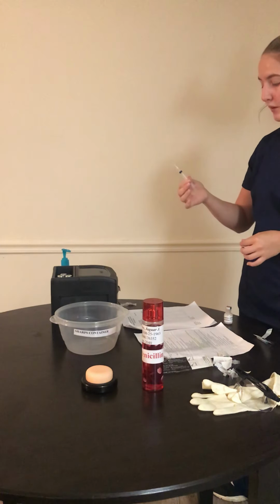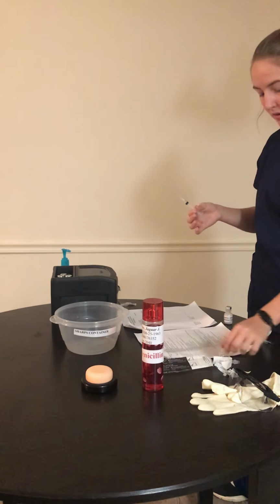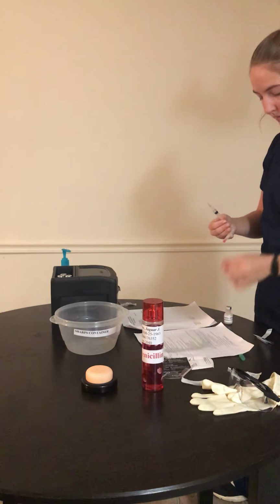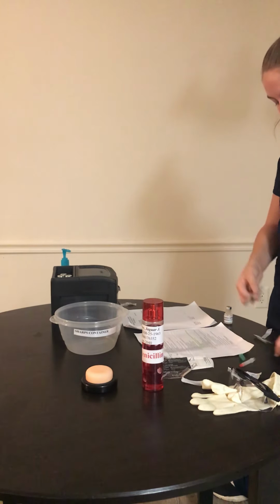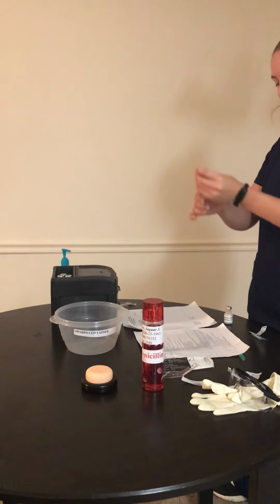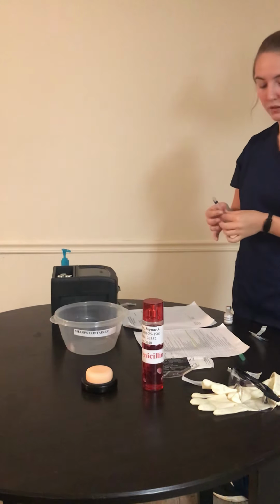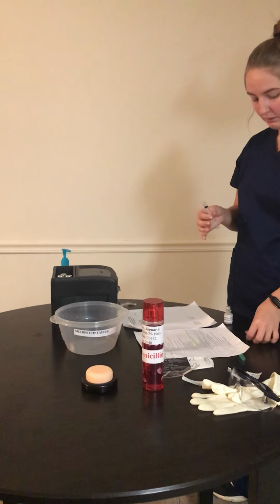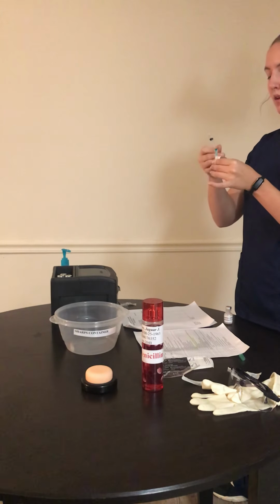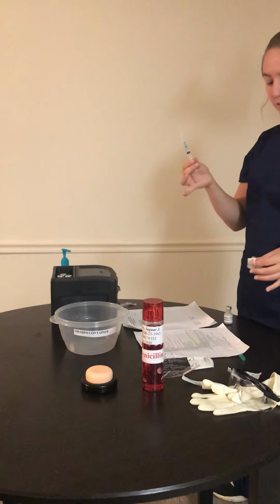So I'm going to take off my blunt cannula by using the scoop method. I'm going to remove it from my syringe and dispose of it correctly. I am then going to take my 23 gauge needle, open it, and attach it to my syringe.